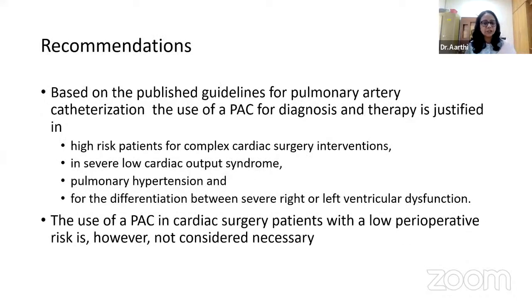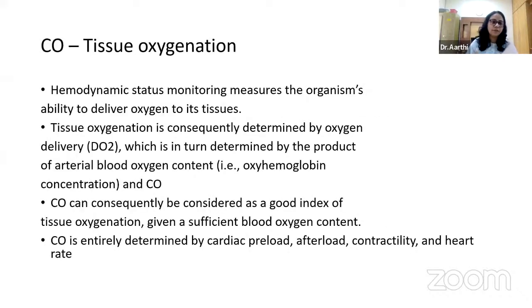So what are the recommendations? As I said earlier, the indications of PACs based on the guidelines are patients at high risk for complex cardiac interventions, severe low cardiac output syndromes, and patients with high pulmonary hypertension, where you have to have the diagnosis and differentiation between severe right and left ventricular dysfunctions. And there is no role for PACs in low perioperative risk patients at present.